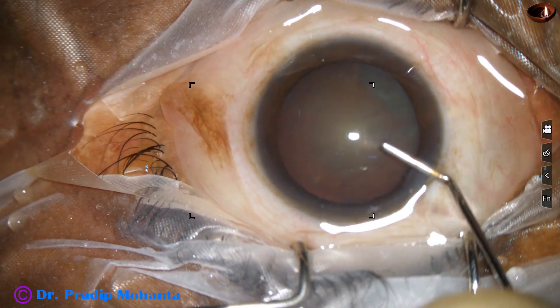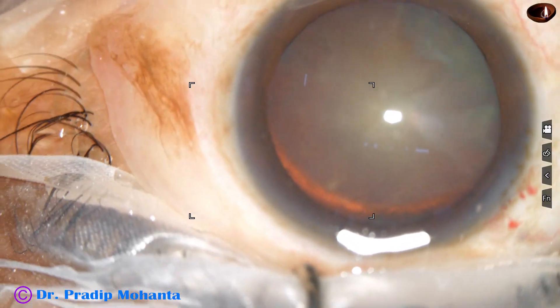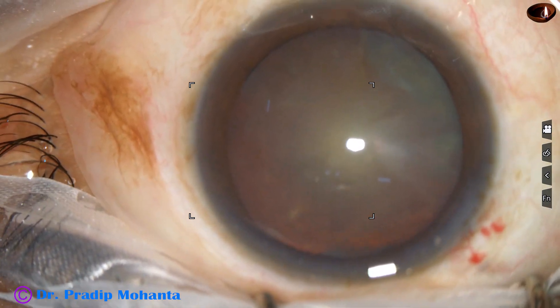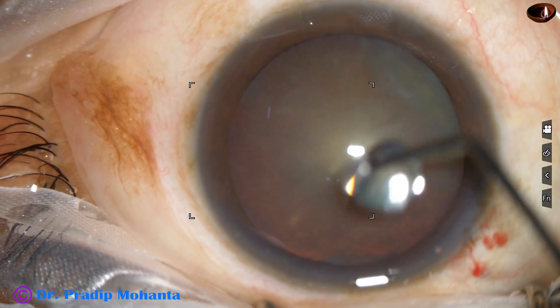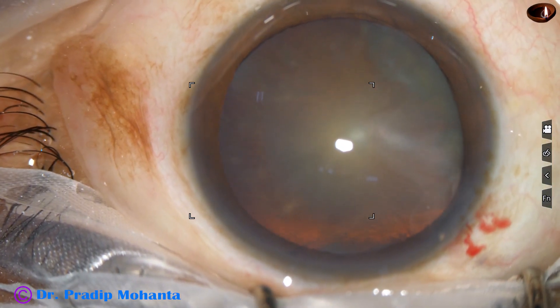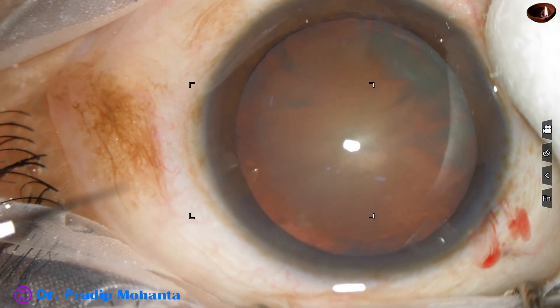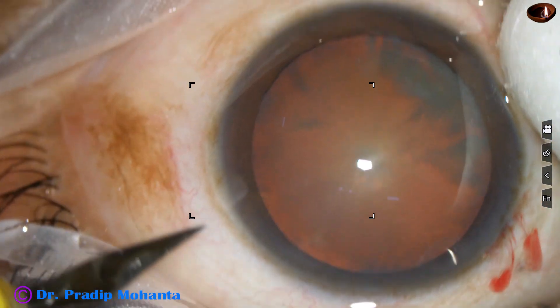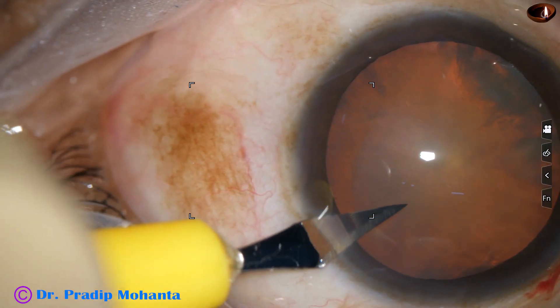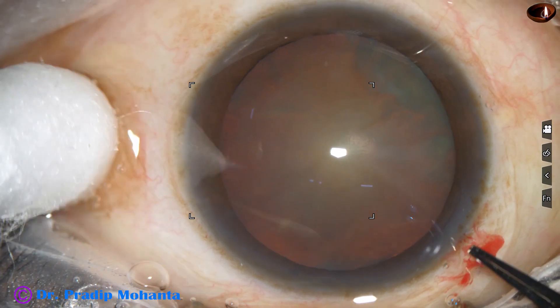The anterior chamber is filled up with 2% hydroxypropyl methyl cellulose. This is a totally unedited recording — you are not going to miss anything in this surgery. Visco is applied over the cornea for better visibility. A side port on the left side of the main incision is to be made, and this is a lancet knife. A side port of width about 1.7 mm is made.